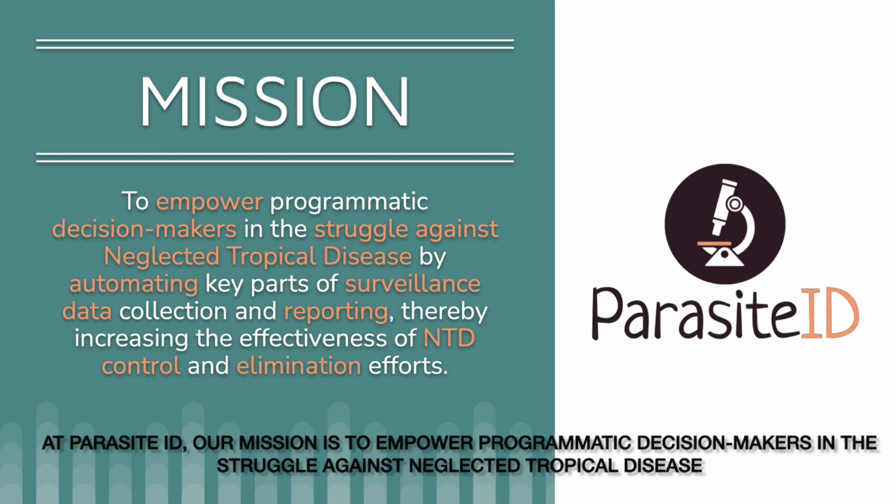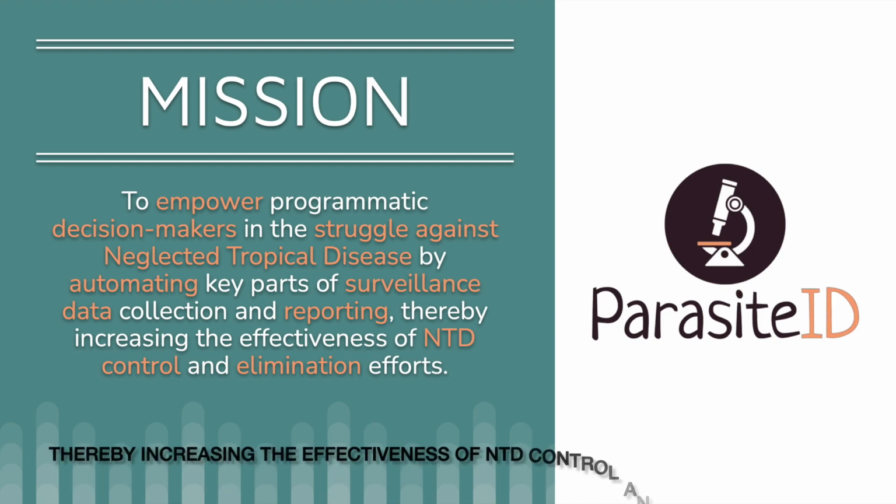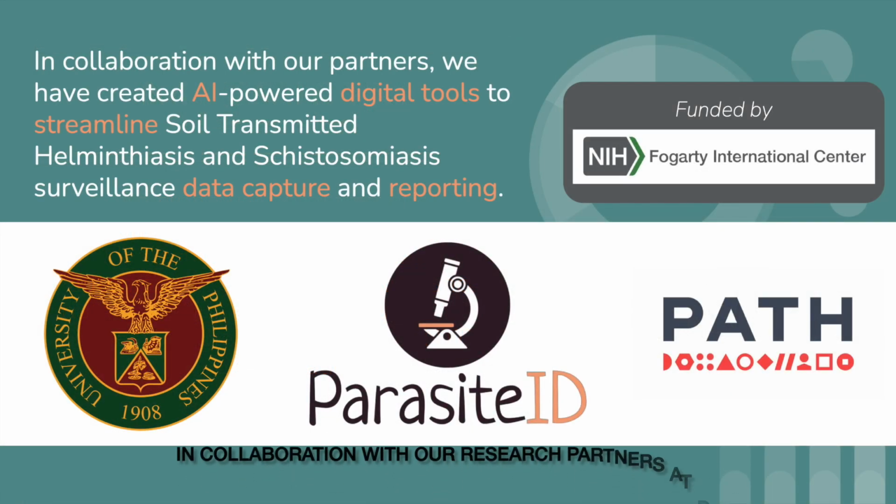At Parasite ID, our mission is to empower programmatic decision makers in the struggle against neglected tropical disease by automating key parts of surveillance data collection and reporting, thereby increasing the effectiveness of NTD control and elimination efforts. In collaboration with our research partners at PATH and the College of Public Health at the University of the Philippines, Manila, we have created AI-enabled digital tools to streamline soil-transmitted helminthiasis and schistosomiasis surveillance data capture and reporting.